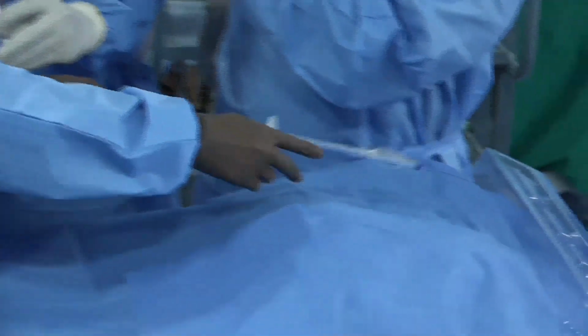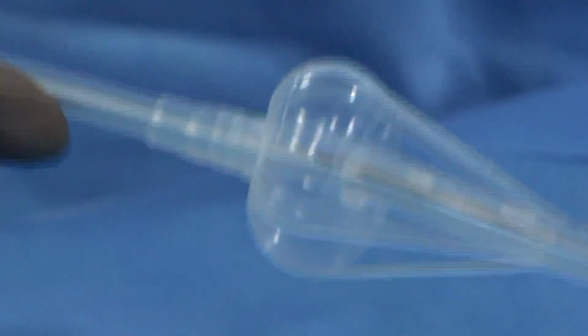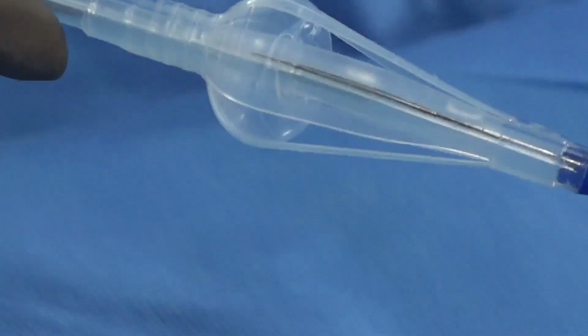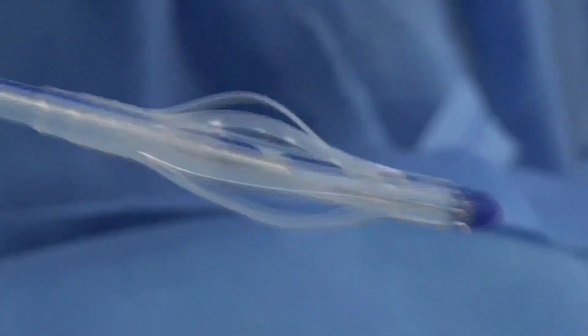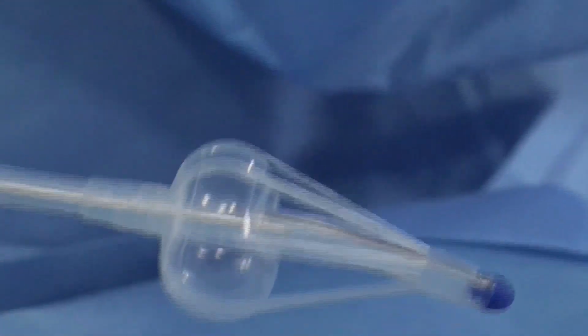Please focus here. See, can you see this balloon has been inflated? Can you deflate it, please? Suck it out. See, it gets deflated. So while introducing, it is in a deflated state, and once it is positioned appropriately, inflate it again. Keep the focus. So there you go. And then you can retract it sufficiently when it is safe enough.